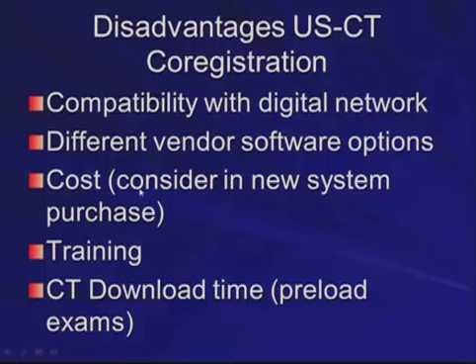This particular feature does generally cost extra. It's an option. So, you have to decide whether it's worth the money for your department, but at least in our department, it really has been worthwhile. It does take some time to learn the software, and so just make sure that you have adequate training time set aside for your sonographers and radiologists so they feel comfortable using the technique.